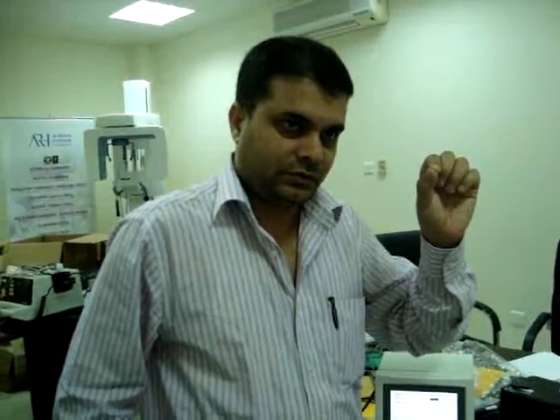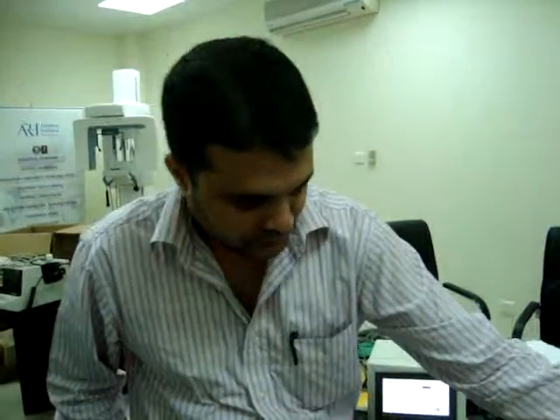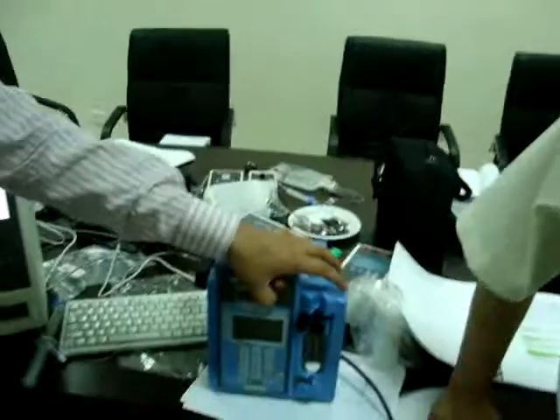But you will have to wait after that, because maybe the doctor is not there, or maybe the doctor will say, okay, we observe for 2 more hours and then decide. During this time, you want the port to be open. You don't want any clogging there. So you set a very minimum flow rate. This is the Keep Vein Open flow.